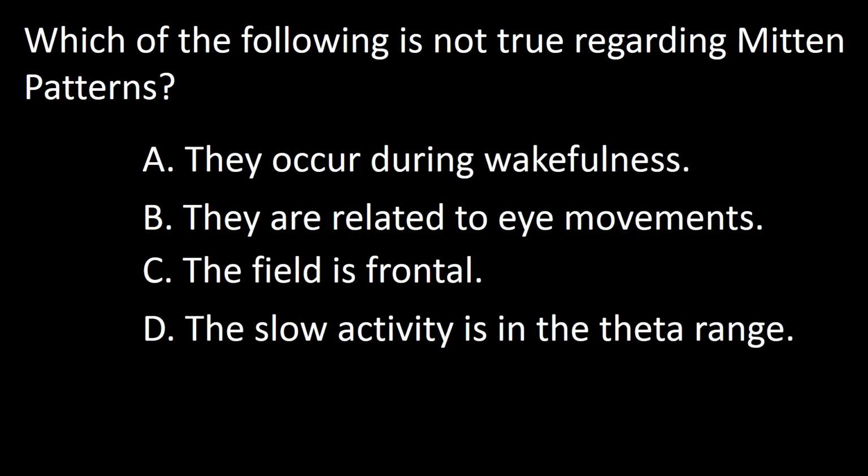Next question. Which of the following is not true regarding mitten patterns? A. They occur during wakefulness. B. They are related to eye movements. C. The field is frontal. D. The slow activity is in the theta range.